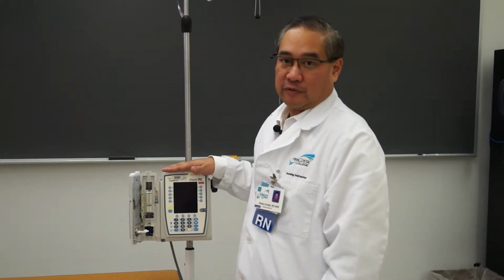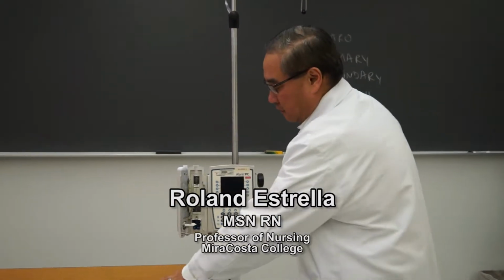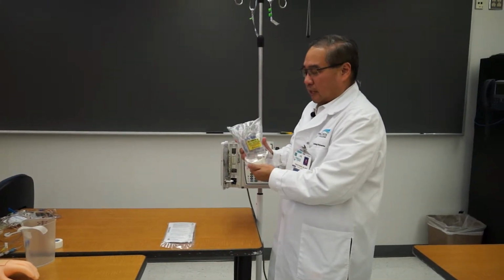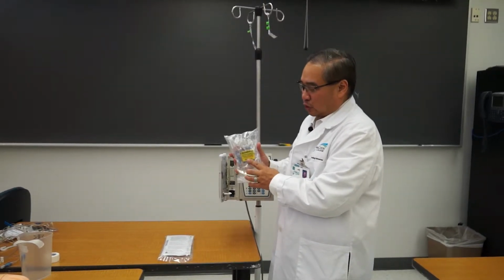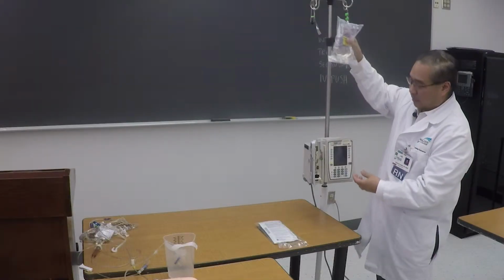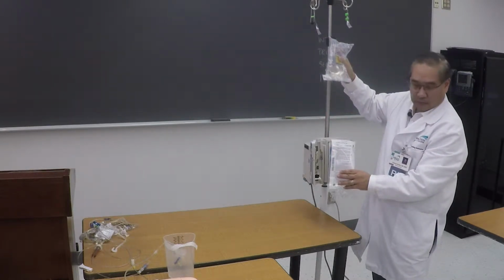Hi. So about the Alaris pump here, in this section we'll talk about hanging a primary infusion. With the primary infusion, you want to check the doctor's order to find out which primary bag you want to run. In this case, we're going to assume that the order mentioned using normal saline or 0.9% sodium chloride. This in conjunction with the pump means that I have to have a way to hang the bag up here and have tubing that will run through the pump.